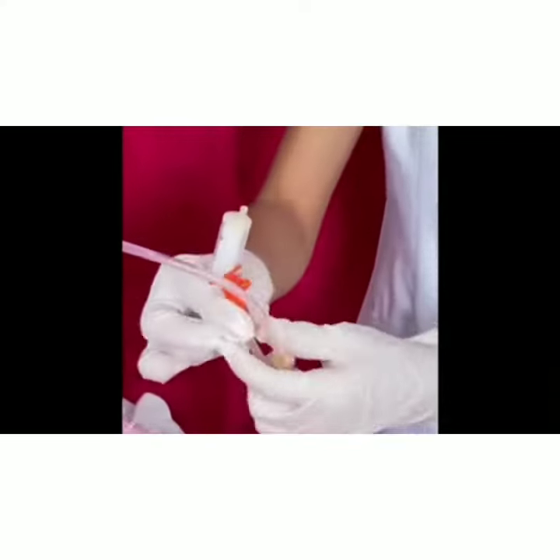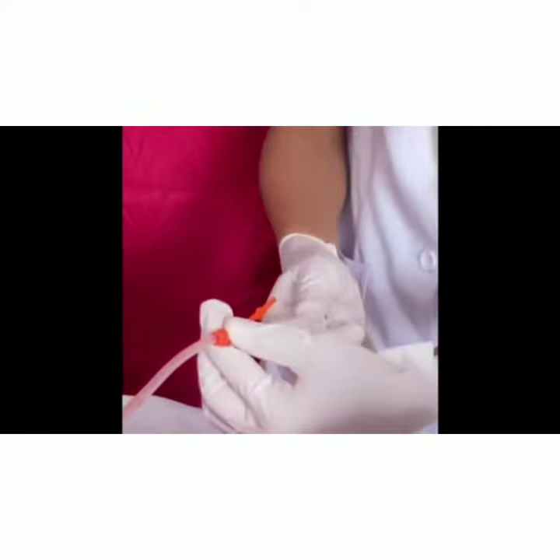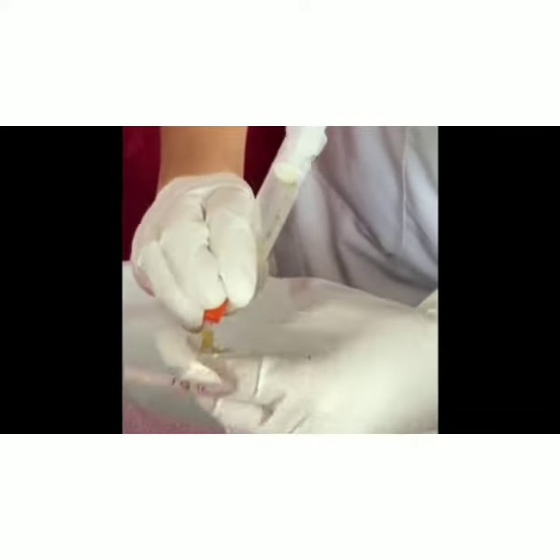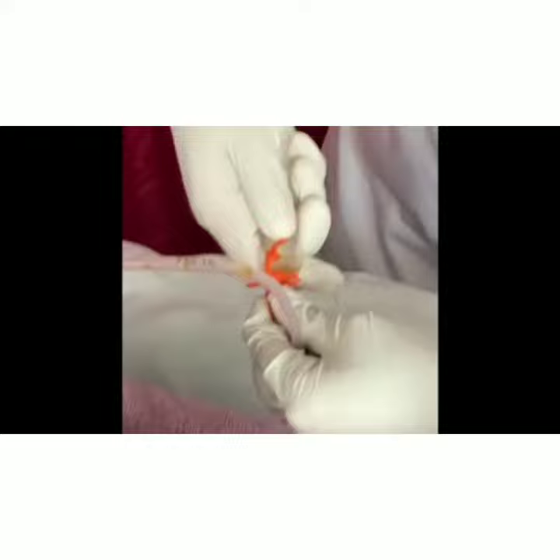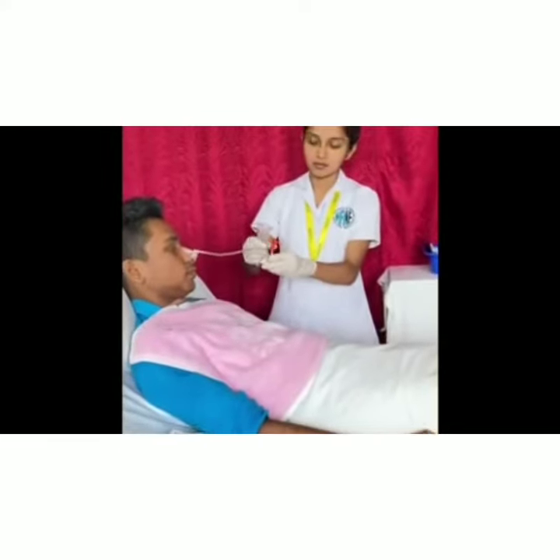Aspirate stomach contents if there is doubt about tube placement. Inform the physician and obtain an order for X-ray. If tube placement is confirmed in the stomach, pinch the feeding tube and attach the barrel of the feeding syringe to the tube.